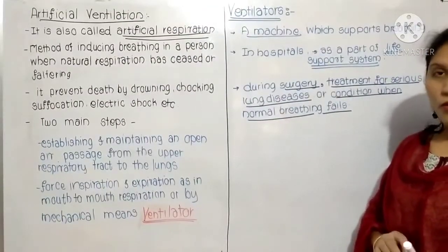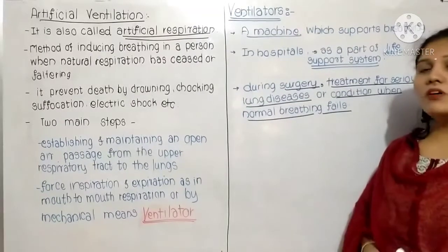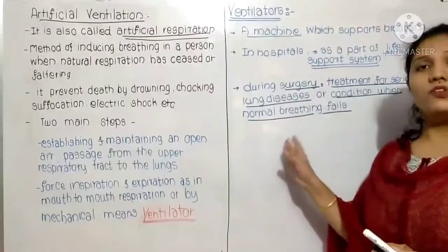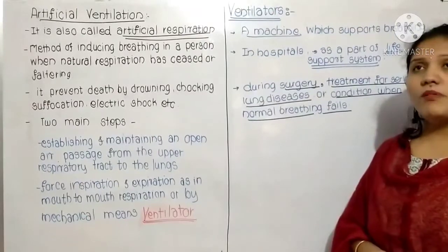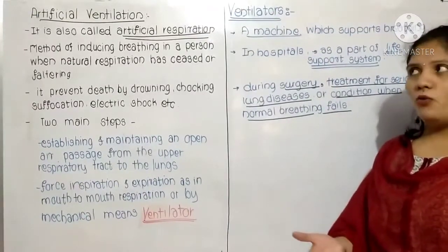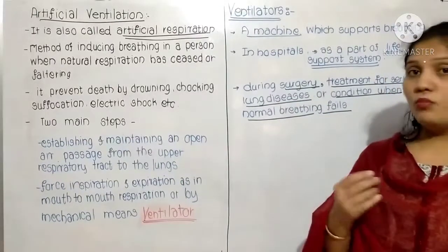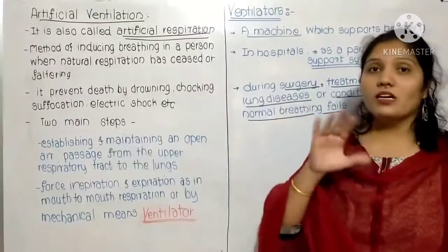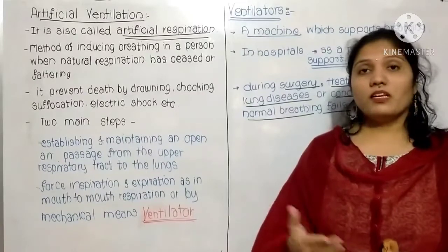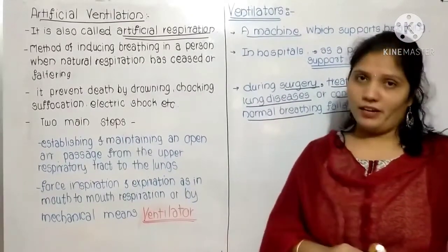You all know that whenever there is a stage at which the person is totally unable to breathe, doctors put that patient on the ventilator. For example, nowadays the season is of corona. In corona, one of the symptoms is that the person is unable to breathe properly, and generally at the last stage they use ventilators.